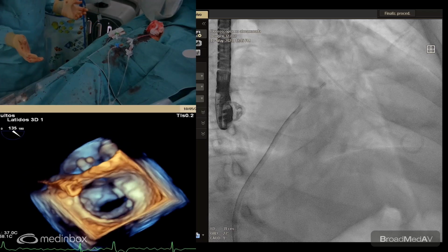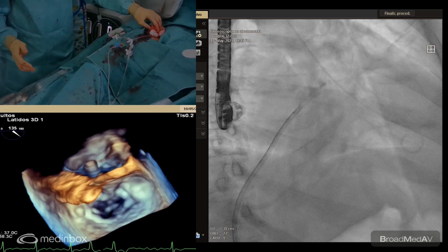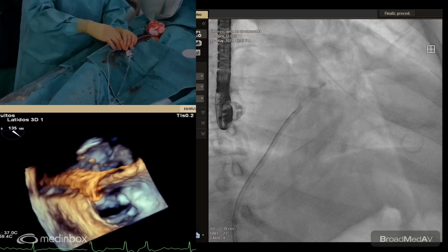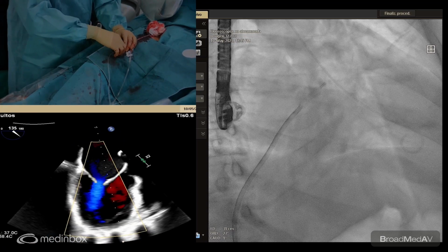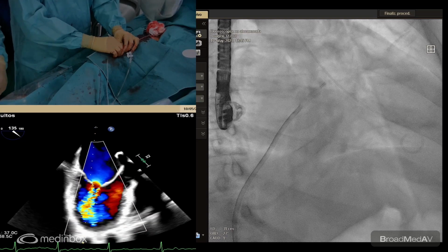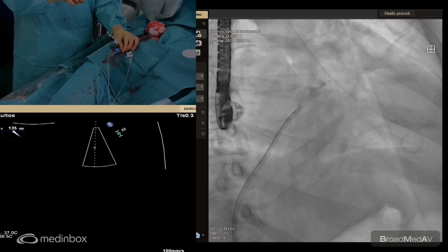Again, the ridges, yeah, indeed, the medial commissure is open as well. I would aim for the lateral one because the medial one is calcified, but the medial commissure is open as well. So no sé, bueno, es igual. The result is very good, I would say.